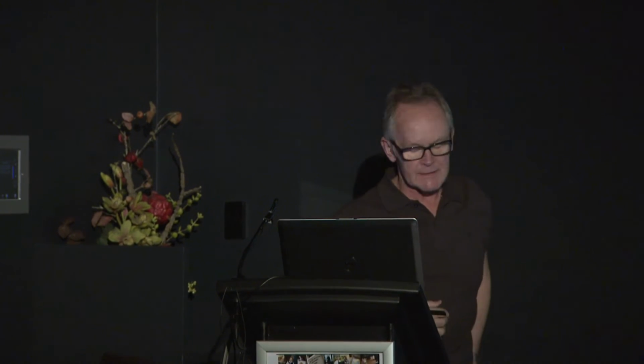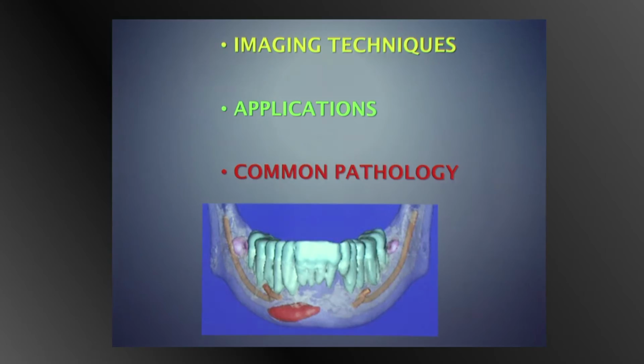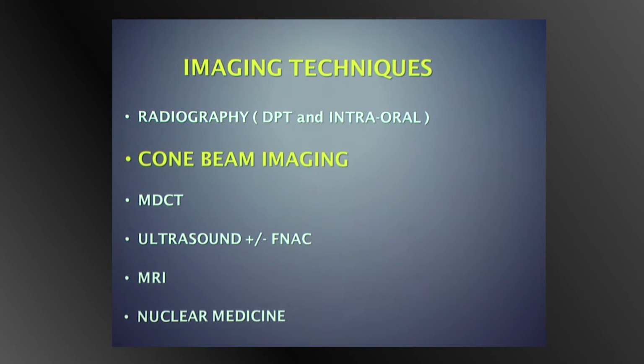Start this afternoon with advanced imaging in the maxillofacial region to complement the two talks from this morning. So we're going to go through imaging techniques, a few applications, and common pathology. The imaging techniques available are radiography, and we've talked about dental panoramic tomography, or the OPG, and the value of high-resolution intraoral imaging as done by dentists, cone beam imaging, which I'm going to talk about first, multi-detector CT, ultrasound a little bit, MRI a little bit, and nukes.